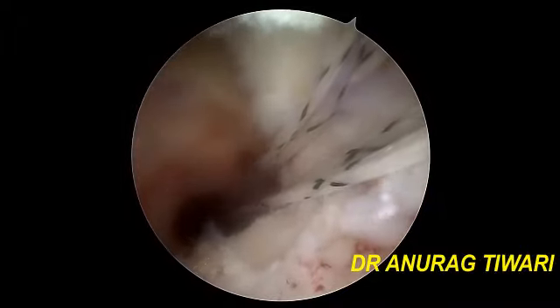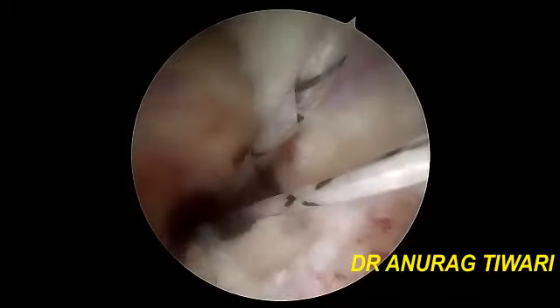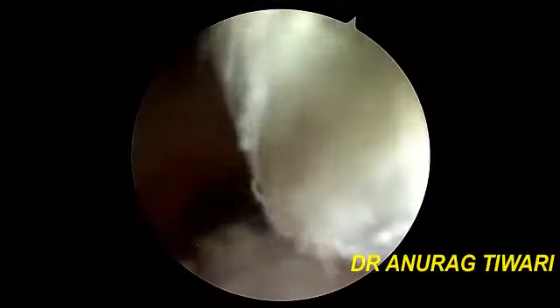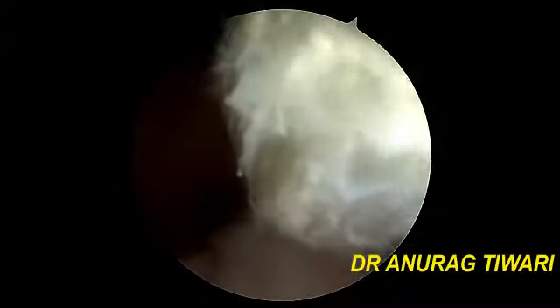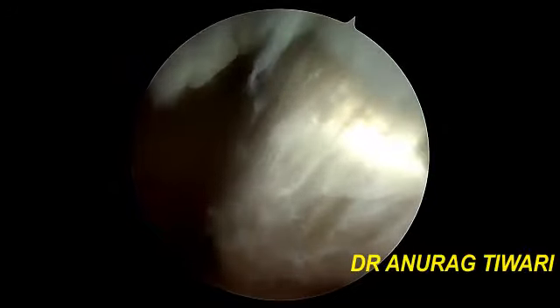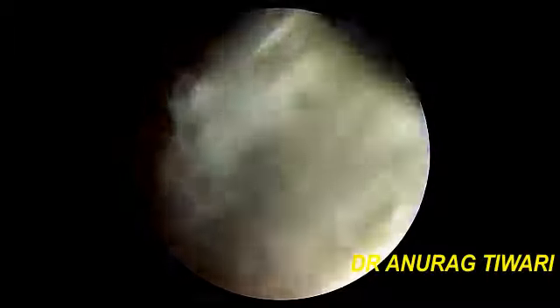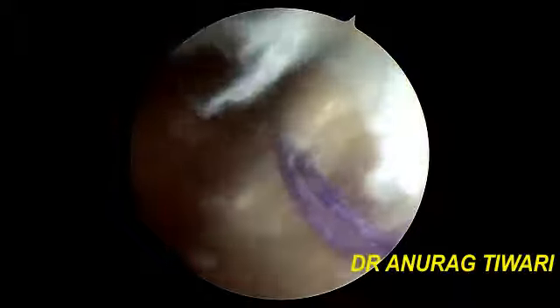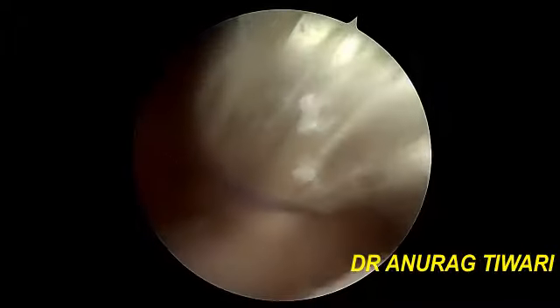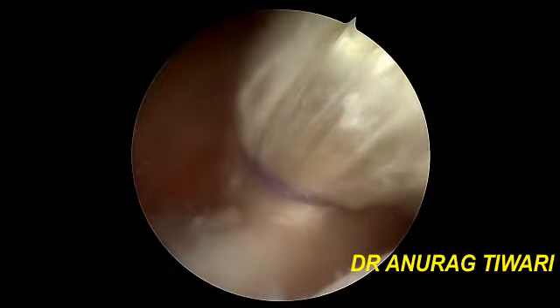Here you will pull the adjustable sutures, and this is pulling the graft. So the graft is coming from the tibial side and is now entering into the femoral tunnel, or the femoral socket. So this shiny white structure is the new graft or the new ligament, 9 mm in diameter. This is peroneus longus tendon, and this is a vicryl mark which we have made in the graft at 20 mm from the end. So this will ensure that the 20 mm graft has adequately gone inside the femoral socket.